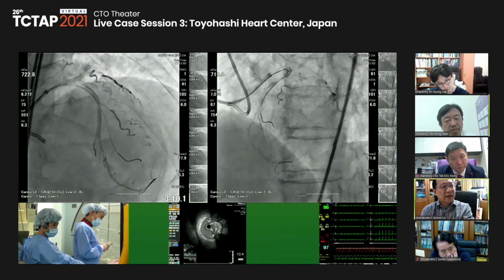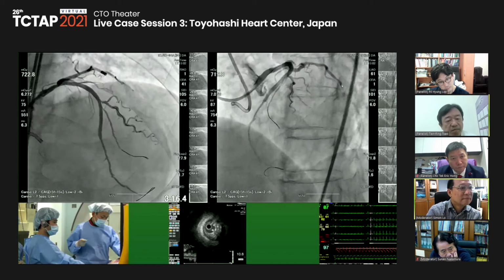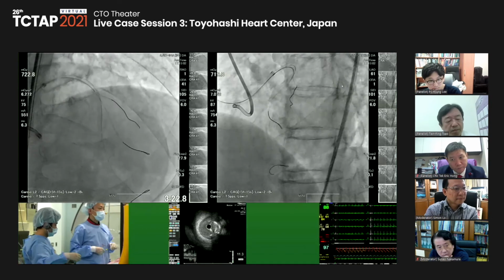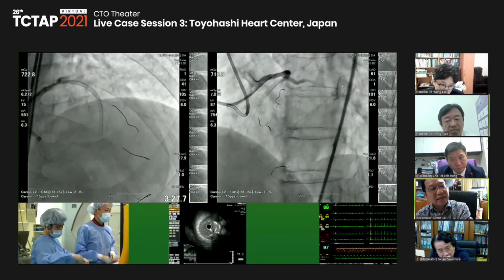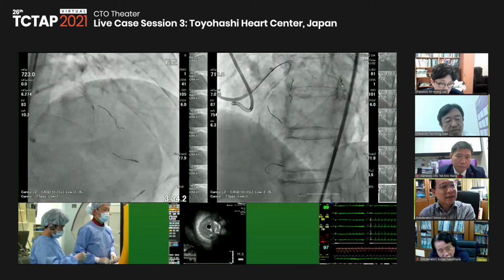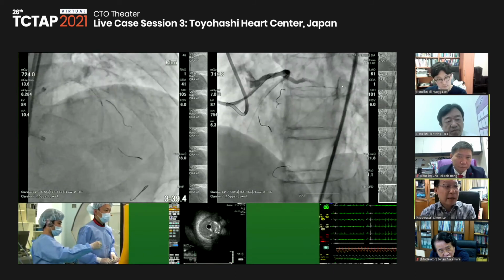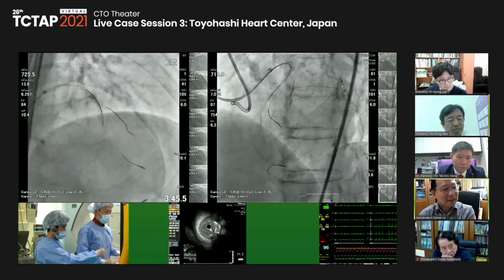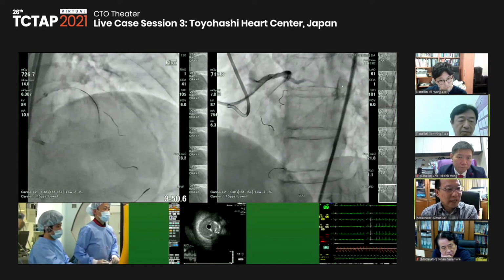Now the ostium of this diagonal looks significant. Well, usually, do you want to implant a stent for the diagonal in this kind of situation? I think most of the panelists in the beginning were thinking of a provisional stenting, a single stent, and then if necessary, dilate the side branch diagonal using a balloon, perhaps a kissing balloon technique. Okay. I'm very impressed with your technique of balloon protection outside the stent.